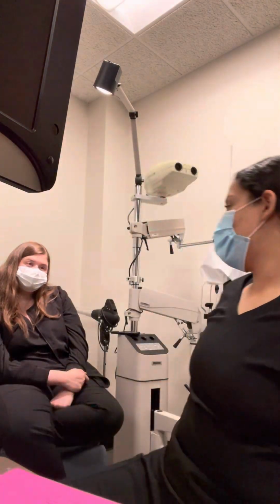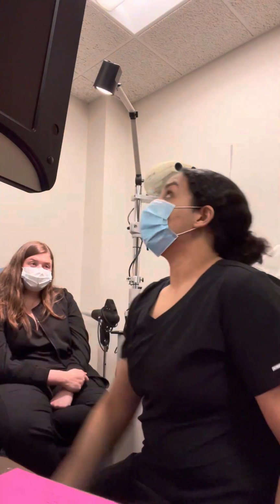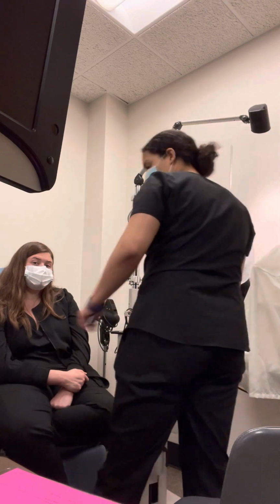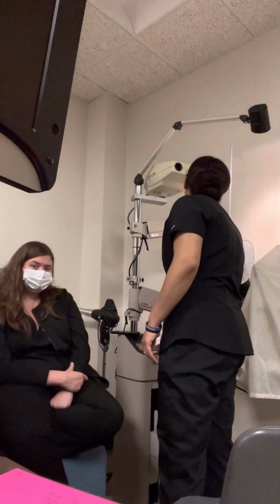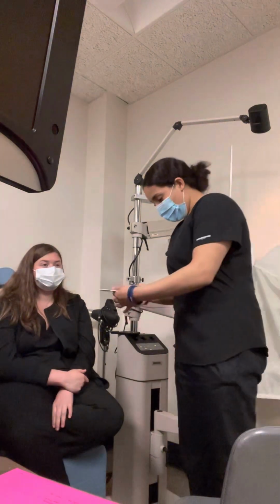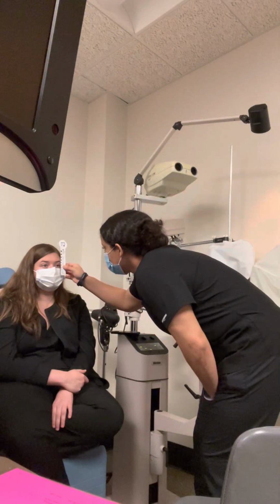Okay, all right, next I'm just going to be checking your pupil size in dim lighting, okay? And what I'm going to do is shut that off. Now I'm going to be testing your eye. There we go. Okay, so go ahead and stare at that screen for me.